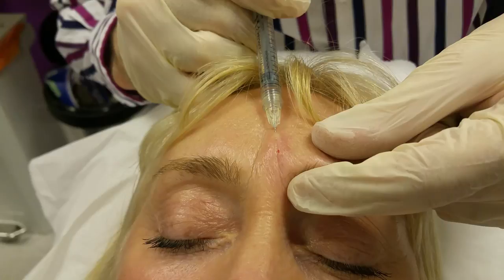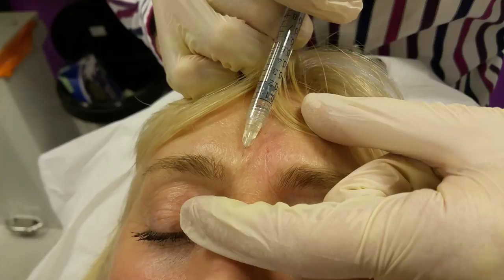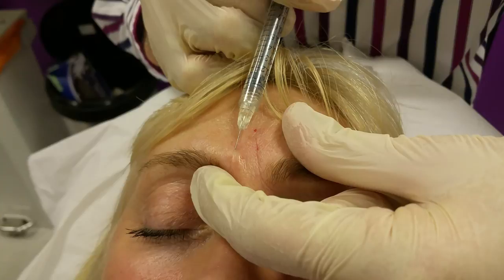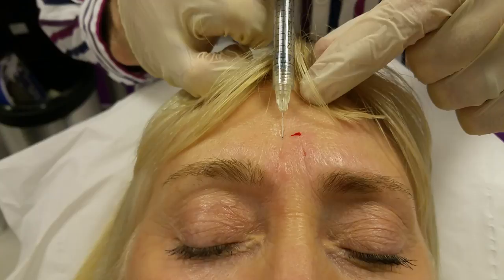Now we repeat on this side — similar thing. Rest on top, break the skin, tent the skin, slide it in, depth check, aspirate, compress the artery, go backwards. Going back in slightly, repeating. And the last one.